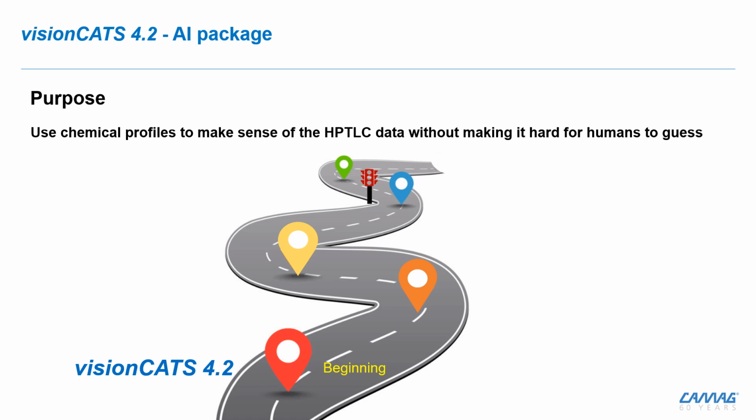What we will see today is just the beginning. These features are part of a broader strategic roadmap. They represent the first wave in our planned series of AI tools that will continue to roll out in the future. All are designed to make the lab workflow smarter, faster, more efficient, and more reproducible.